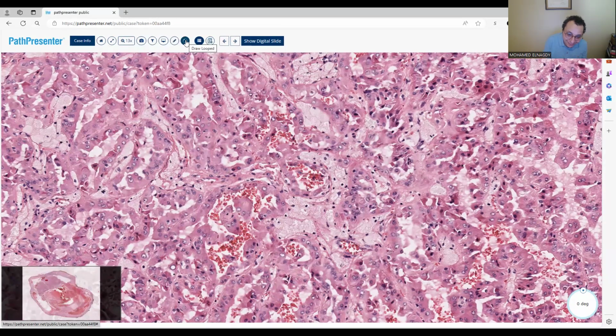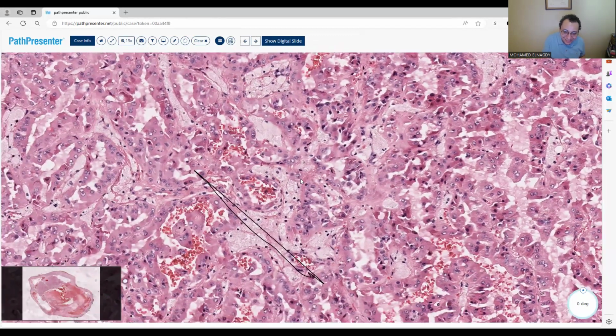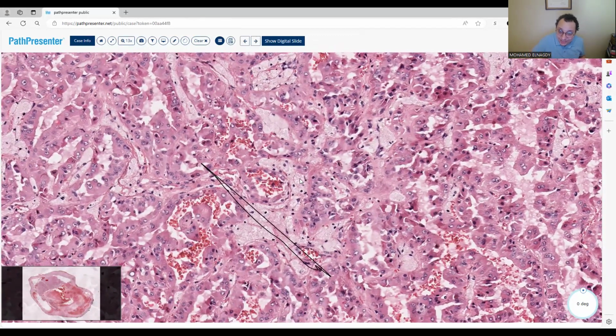I don't know if I can start ordering staining now, but maybe not yet. You can start ordering stains, but before ordering stains, can anybody else jump in? These are cells with a little bit pinkish cytoplasm. Oh, maybe macrophages. Ah, yeah, here we go. Dina said it actually on the chat. What do you think, Dina? You mentioned that when we see the macrophages and the blood, it looks papillary. And what is this?